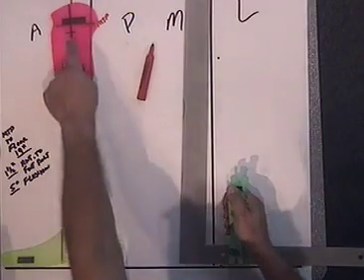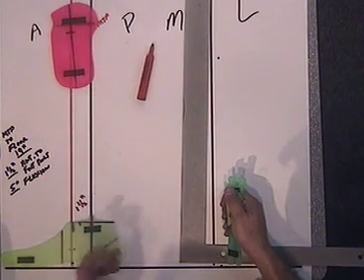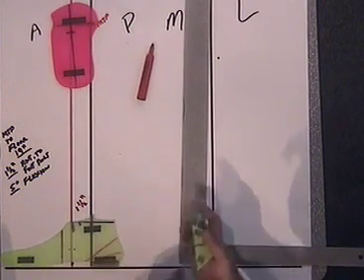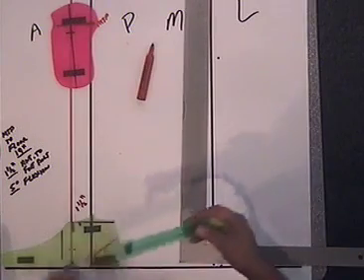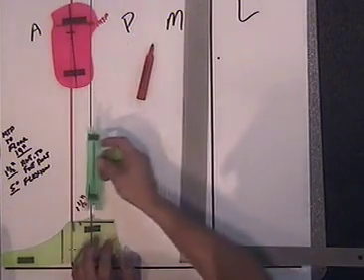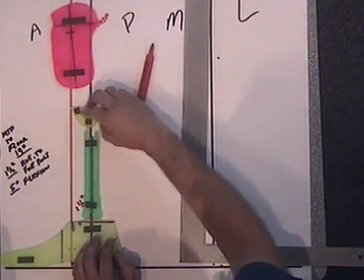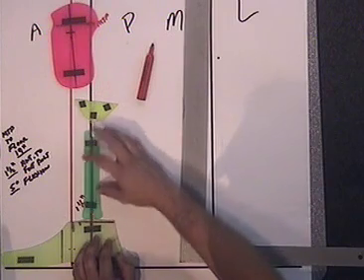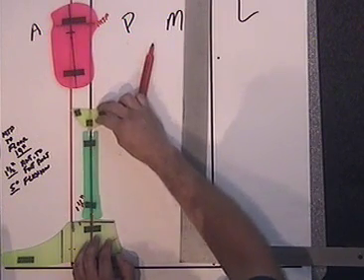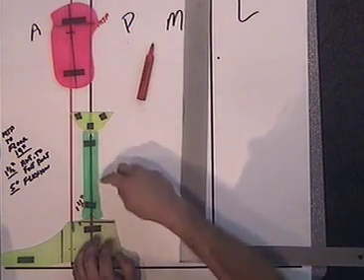We have the correct height set, we have the flexion set, and we have the heel height established down here with about 2 degrees of anterior tilt of the foot. So we've pretty much got everything in its right place. Now we just have to have a way to hook that together. And we use the pylon system to place this on top of the foot and then connect the socket to the foot using these components.